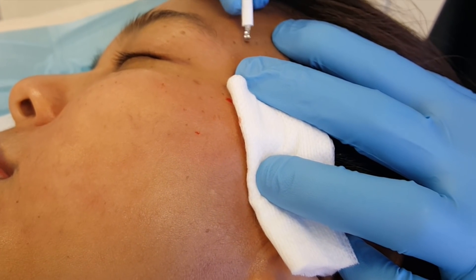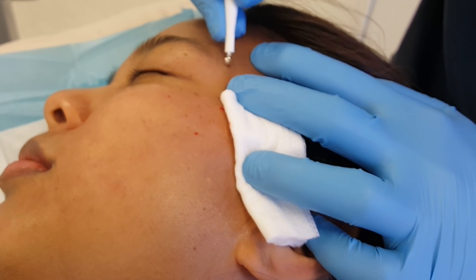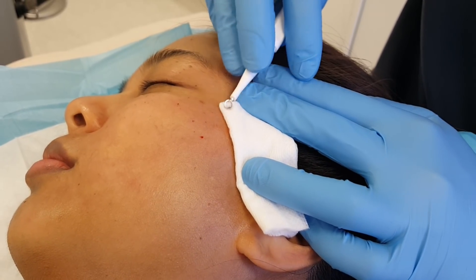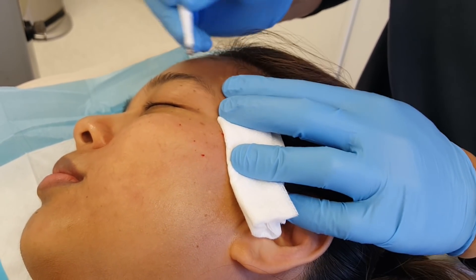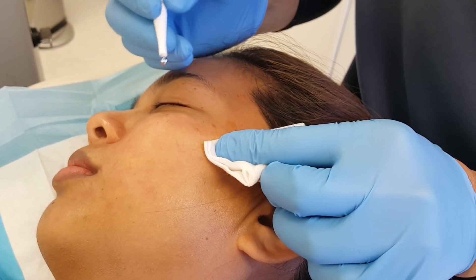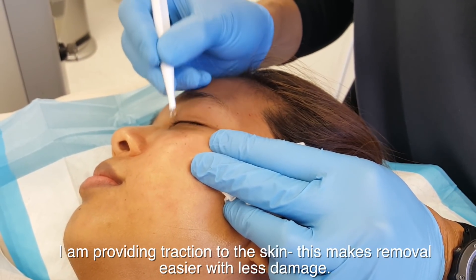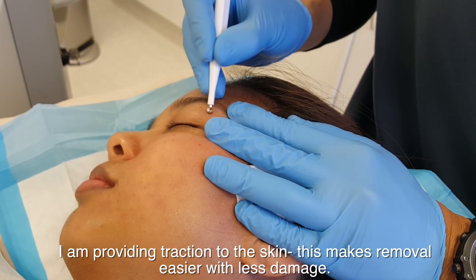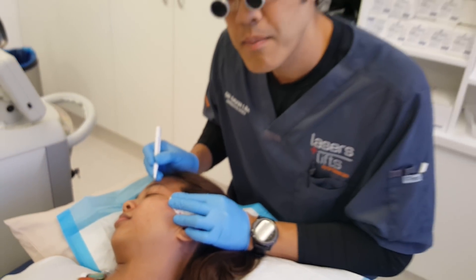If it's too sharp it can cause a little bleeding, but that's not a problem. See how I've removed that one — and that one's gone there as well. You can see the warts extracted on the tip as I move bit by bit. The pinpoint areas of bleeding are absolutely normal — that's what we want. For the bigger lesions, using the curette like this to remove the top works really well.